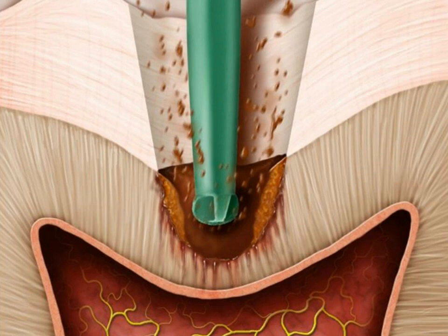This is where SmartBurs is really smart. We can get in with a SmartBur, and I usually will use RPMs on my electric handpiece between 6 and 8,000 RPMs. You don't want to go too fast. But the nice thing about this is you're not going for a second and stopping and looking, going for a second, stopping and looking, hoping you don't have an exposure, wondering if you got all the decay out. That's what happens when you're using a carbide steel burr. With a SmartBur, you put the burr into the lesion, you put your foot on the pedal, and you move the burr around until none of the stuff comes out anymore. And then you're done.